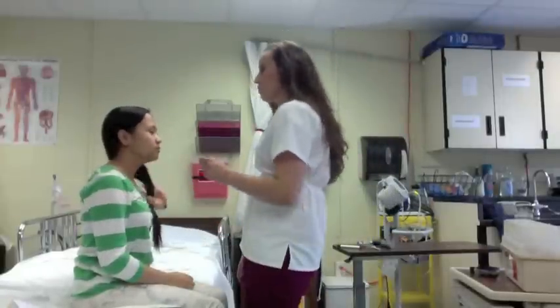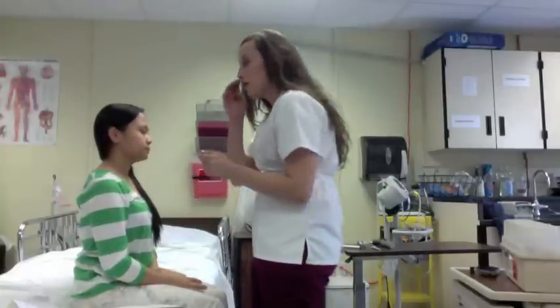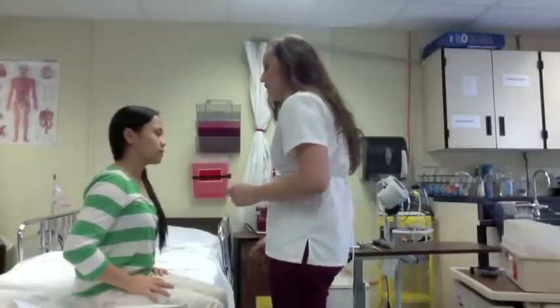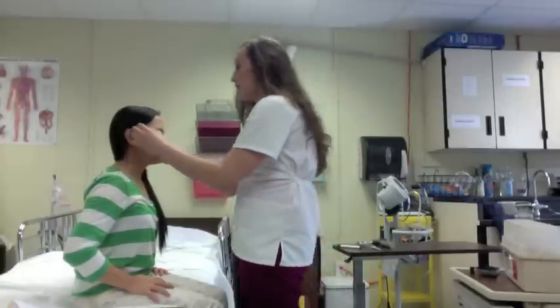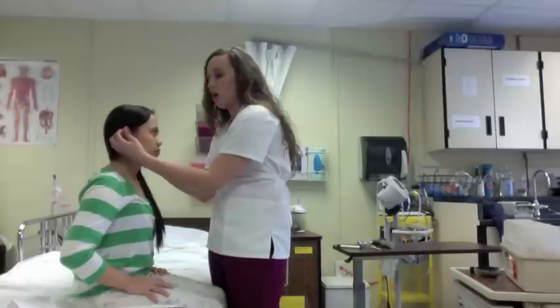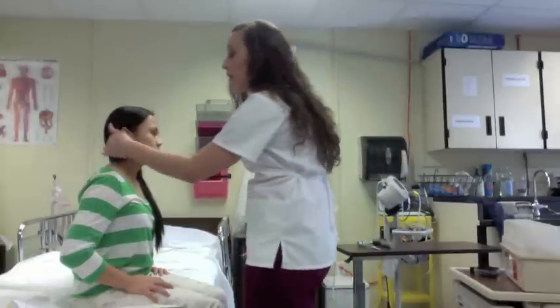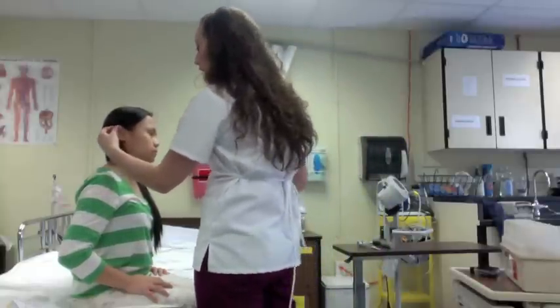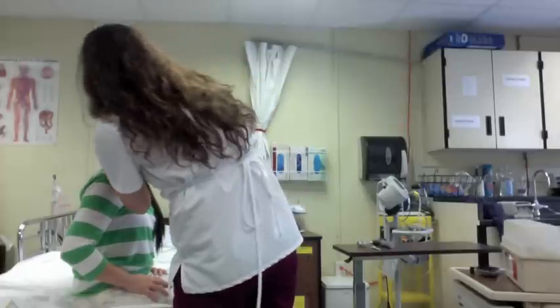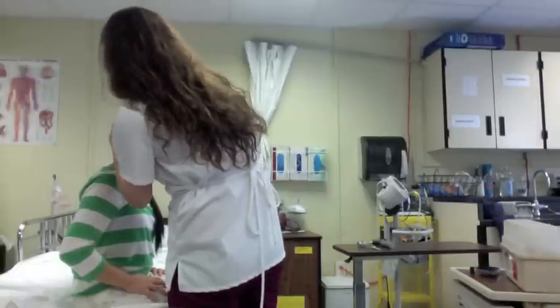Okay, first we just want to look for alignment and position in both ears. We're also going to look for size and shape and symmetry on both sides. Then I'm going to palpate for any tenderness or edema or nodules. Good. Now I'm going to inspect the internal canal, and I'm going to do this by pulling her ear up and back. And I'm looking for any drainage, redness, swelling.